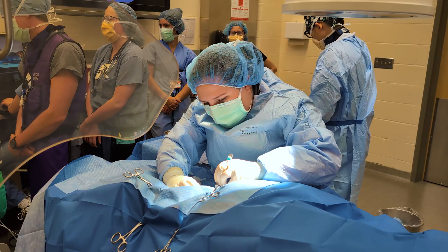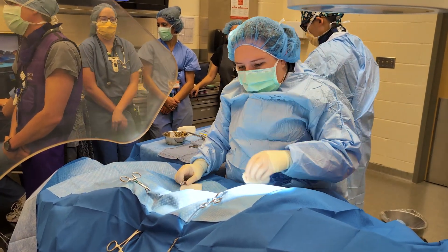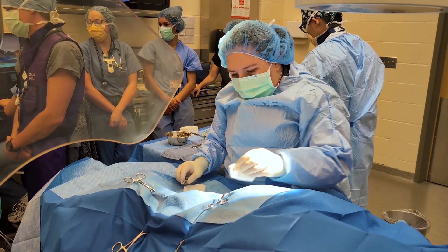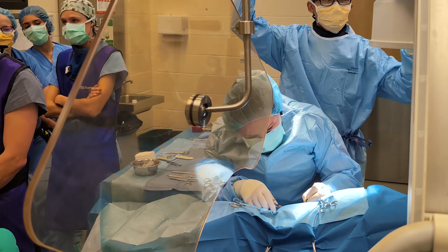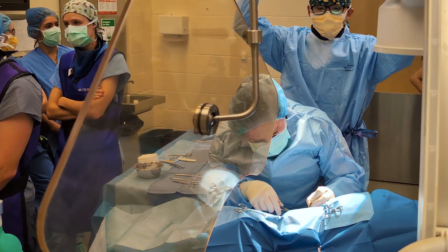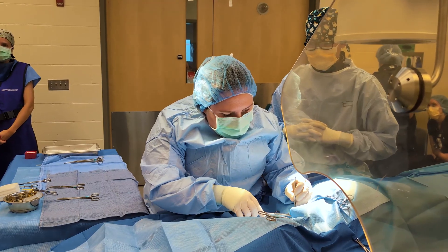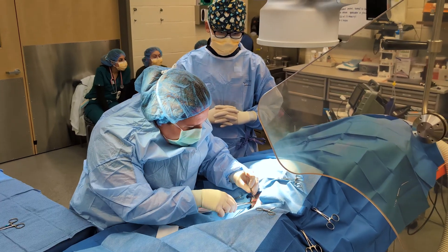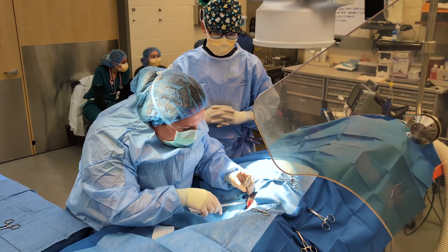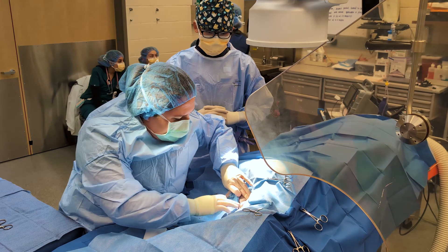We then isolate the jugular veins. We perform a jugular vein cut down, and this is all to the right jugular vein. The jugular vein exists among a lot of other tissues, so we use surgical instruments to open up the skin and expose the jugular vein and separate it from all these other tissues so we have access to it.